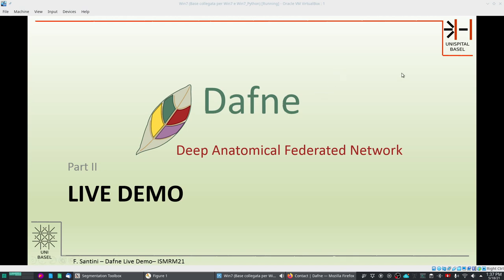Welcome to the second part of this tutorial. In this part we will see how to run Daphne and how to segment a dataset and perform all the practical features that the user interface offers.